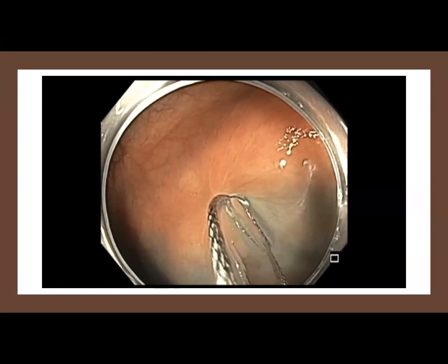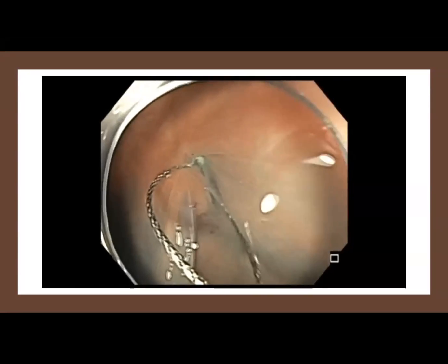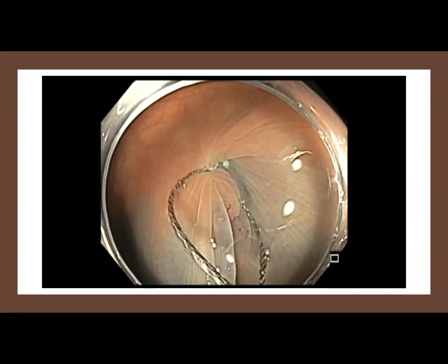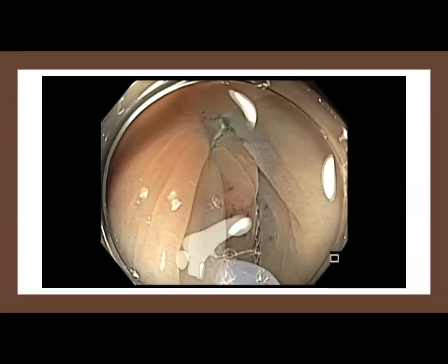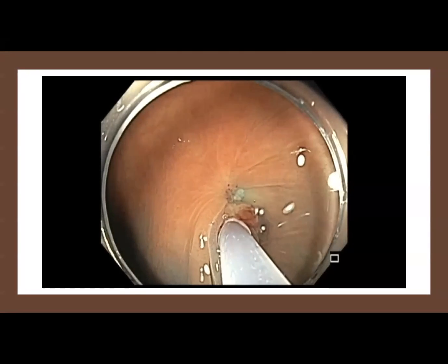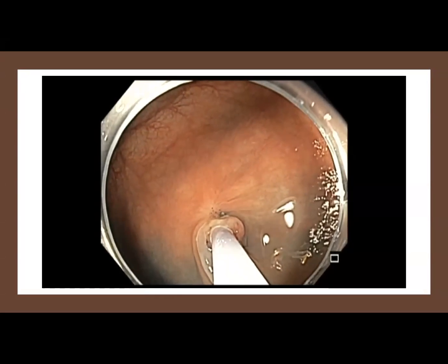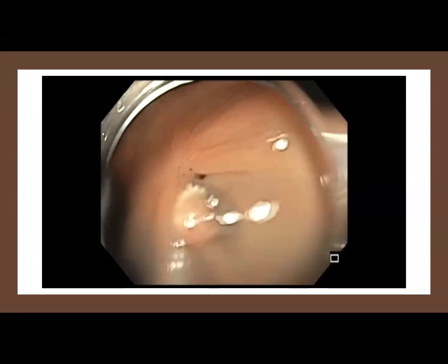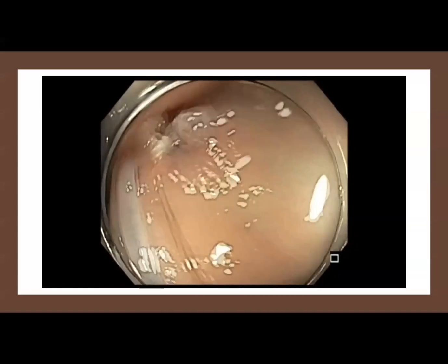It's actually very interesting, since Olympus came out with this cold-cum-hot snare, almost every week I end up with a problem. That is, I ask for my hot snare and the technician takes out a cold-cum-hot snare, and they don't even realize that they picked up a cold-cum-hot snare, which is not ideal when you want to cut a polyp like this. Have you noticed that problem, Roy? Yes. So I don't use it.